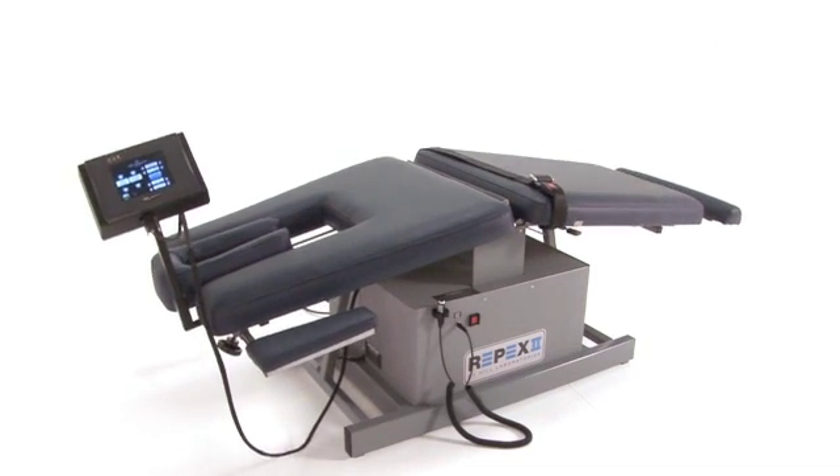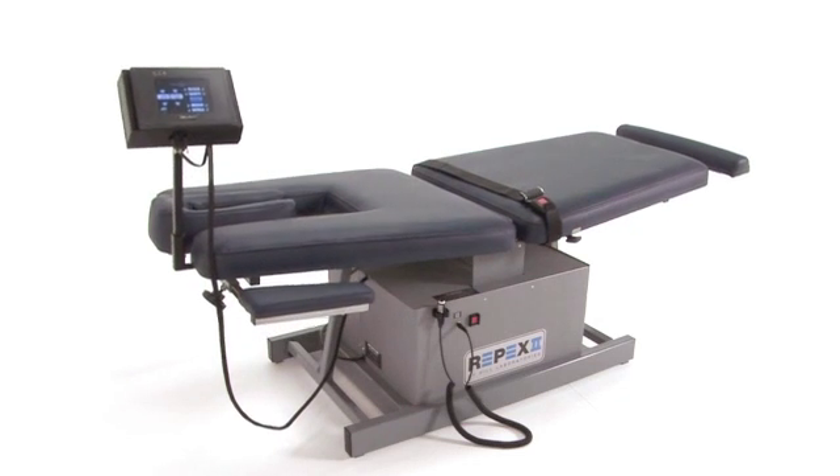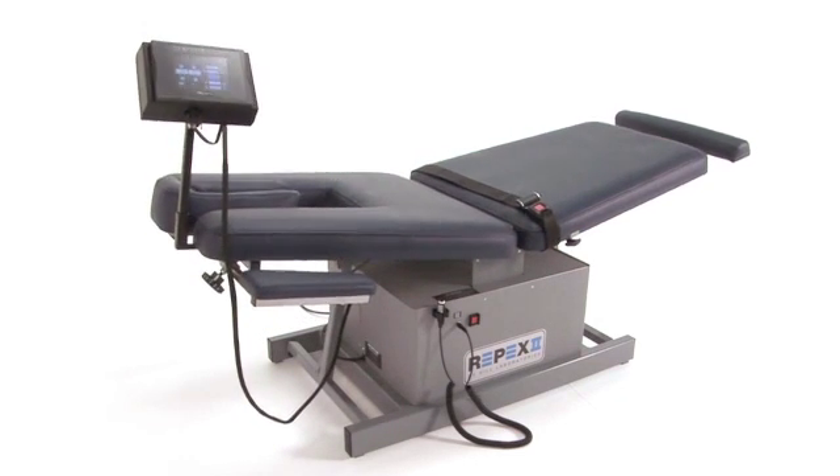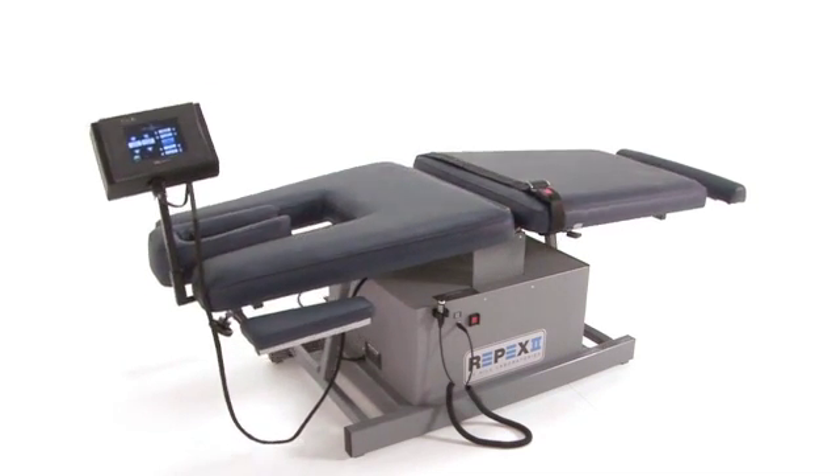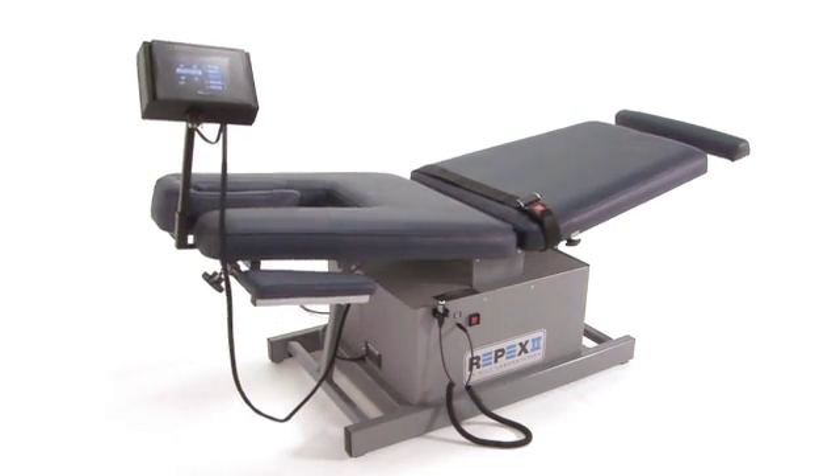The REPEX table provides a means for a greater number of repetitions than is physically possible using patient-generated exercises. The REPEX features a touchscreen control panel and no required options or accessories.